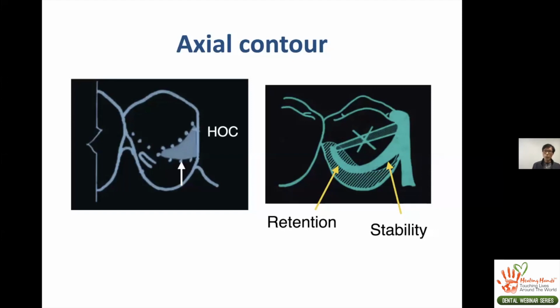The point is that we have to shave the distal facial so that the height of contour can be apicalized in the gingival direction further down into the cervical area, so that we can have the initial two-thirds portion go in the middle, and that gives good stability for the partial framework.